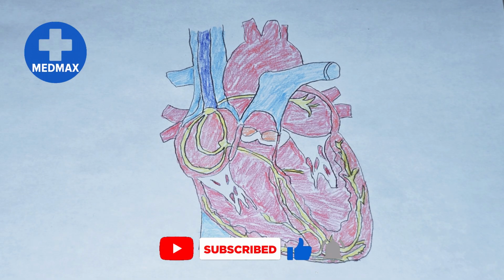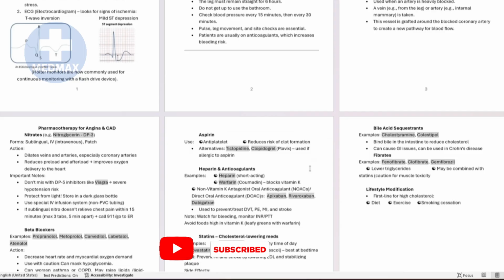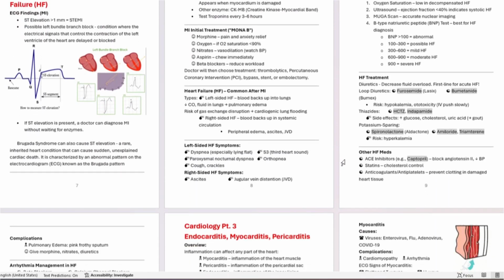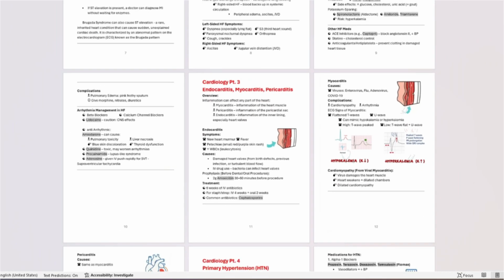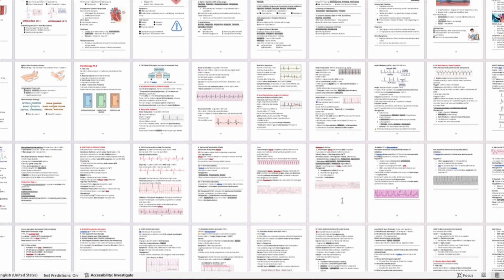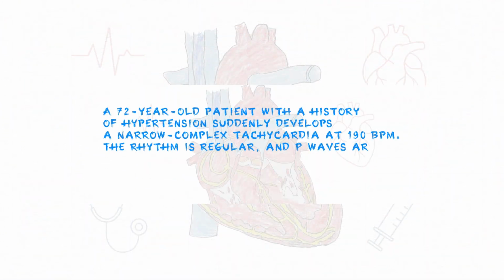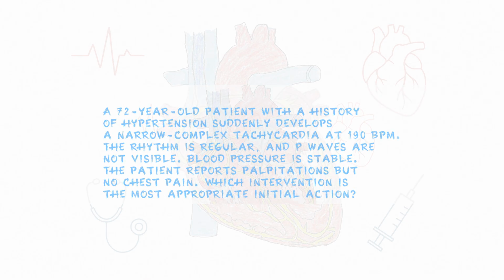This lesson took significant time to prepare because ventricular dysrhythmias require precise visual interpretation. I include many ECG images to help you understand how this life-threatening rhythm actually looks in real clinical practice. And at the end of this lesson, I will reveal the correct answer to last episode's very difficult NCLEX question, along with the detailed explanation.